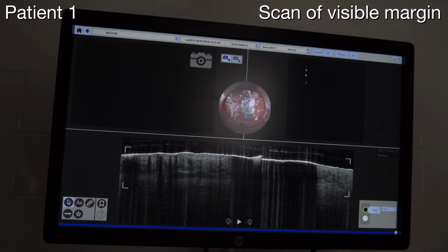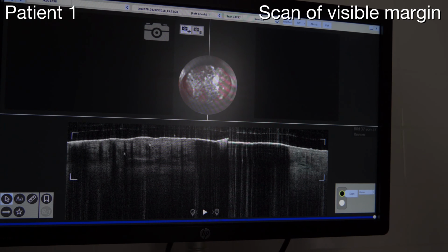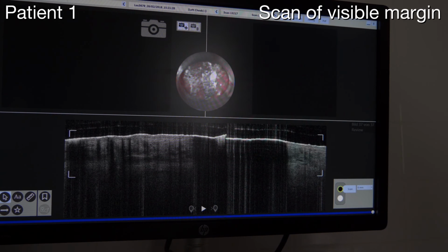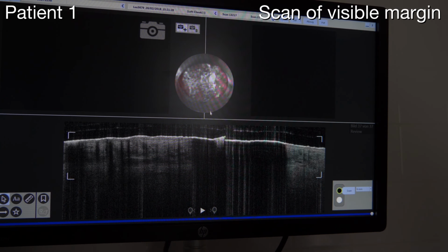Okay, this is also another example. We can see here the first line of my margin mapping, and this is the second, the big one. We can see here the first line, the shadow, and this is the big second shadow.